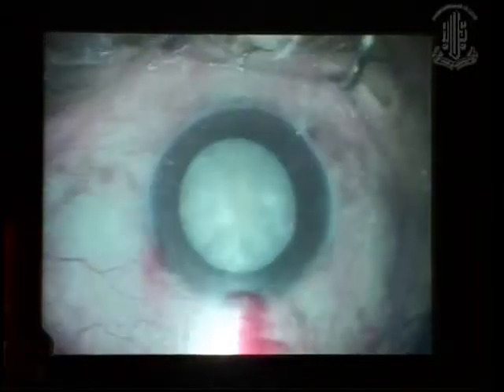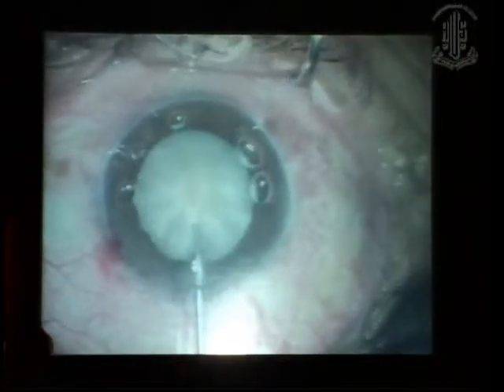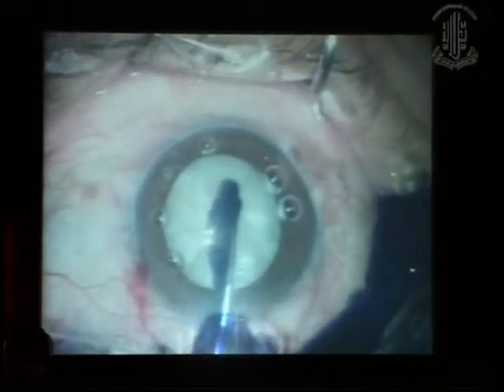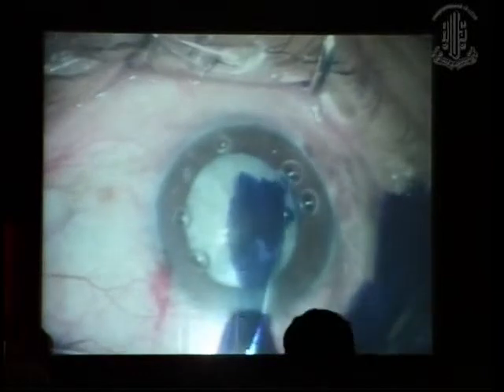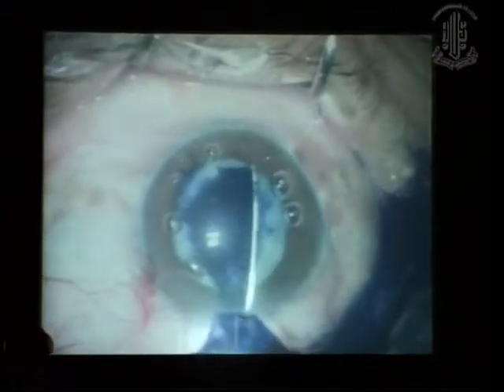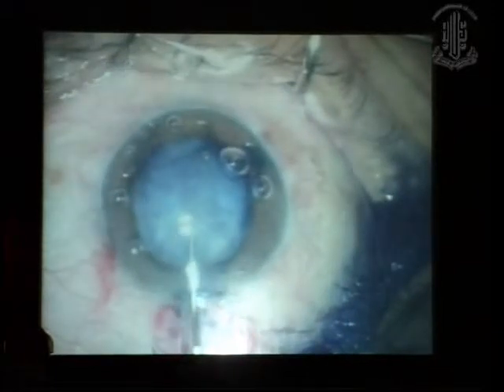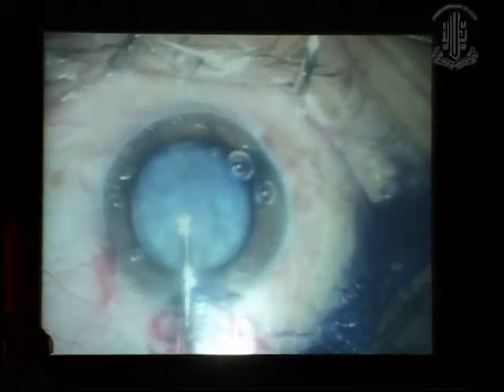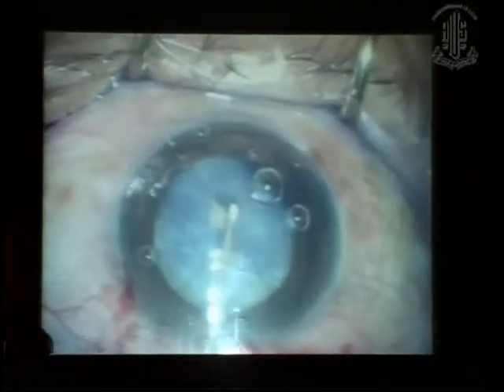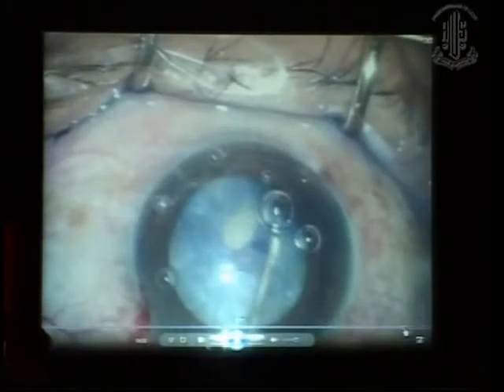And inject viscoelastic and use this cannula. You could use a regular Fogla cannula, so one hole is good. And then we just use the trypan blue on the capsule in a painting manner and under the viscoelastic, whatever viscoelastic you choose to use. The only thing you need is to leave this trypan blue over there for about a minute, and then the staining is fairly good. Though it's a bit patchy, it is good enough to make the transparent capsule pretty visible for a good capsulorhexis. And then we can easily do our rexis, so at least I'm not going to have a nick this time. Well, this we did manage to complete pretty well, as we can see over here.